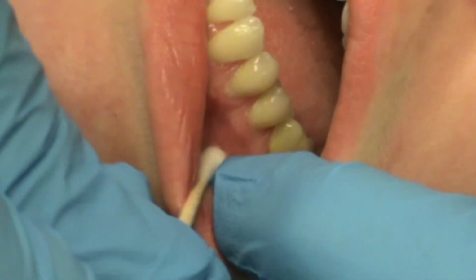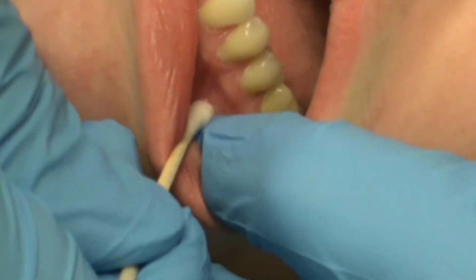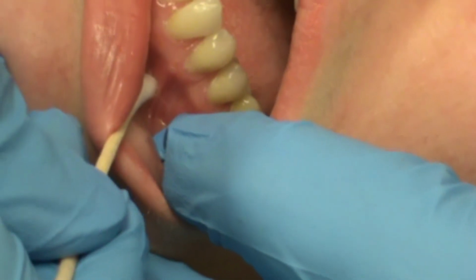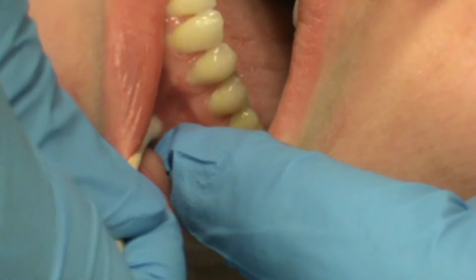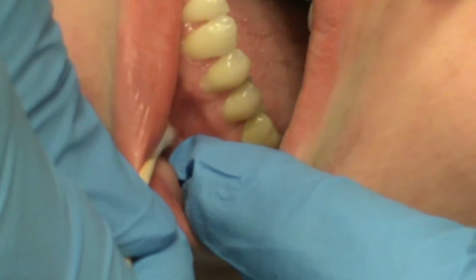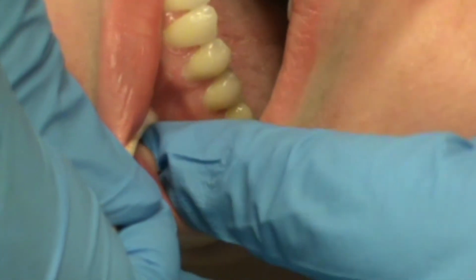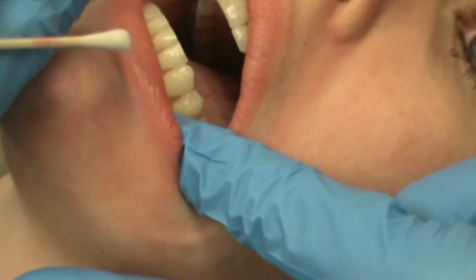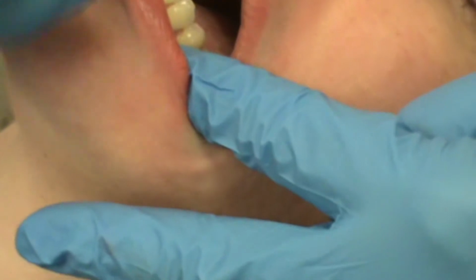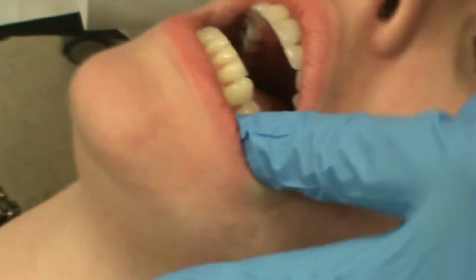You can look in the radiograph. Sometimes it helps you too, because occasionally you'll find the mental foramen closer to the first premolar, but usually at pretty much the tip of the second. And then you can deposit your anesthetic over top of that area and then press with your finger 1.5 to 2 minutes, and we'll soak right in there and numb that tissue up very nicely.